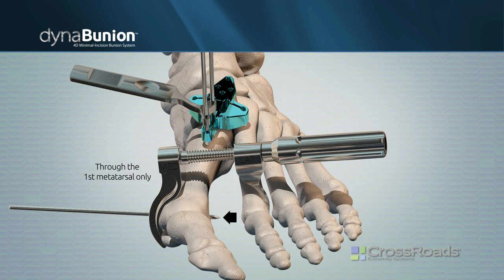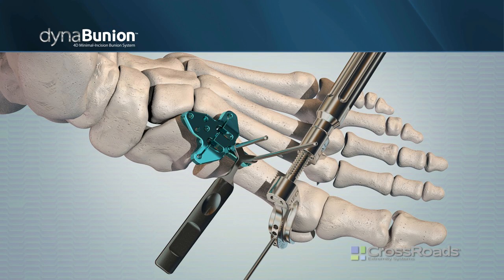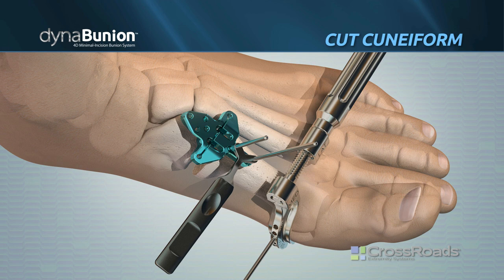Dial in the intermetatarsal angle by turning the reducer knob clockwise until desired reduction is achieved. Utilizing AP fluoroscopy, confirm that the desired IM angle and sesamoid position is achieved. Dorsiflex the hallux to engage the windlass mechanism of the plantar fascia, which will compress the first TMT joint and provide apposition of the cut guide paddle to the medial cuneiform joint surface.